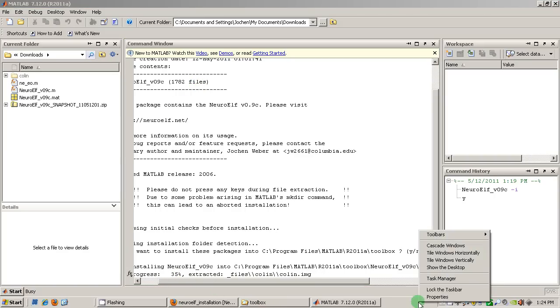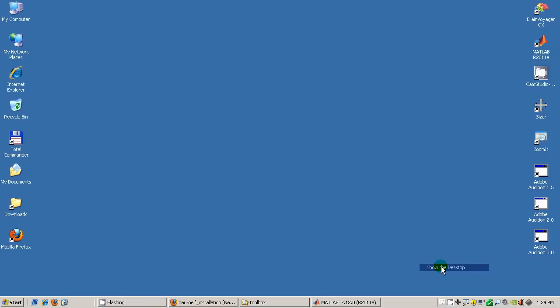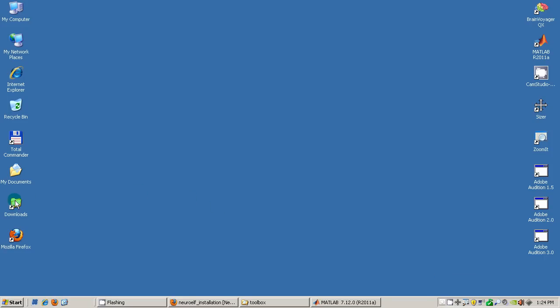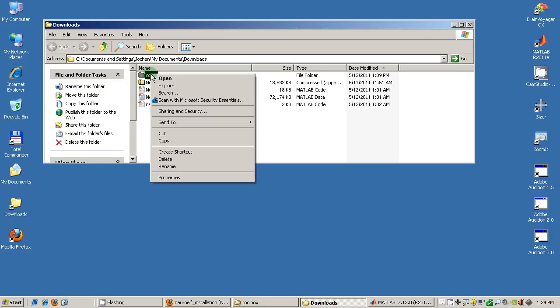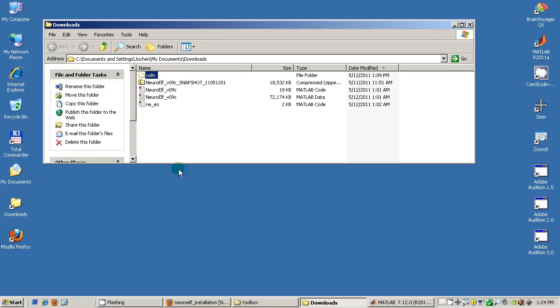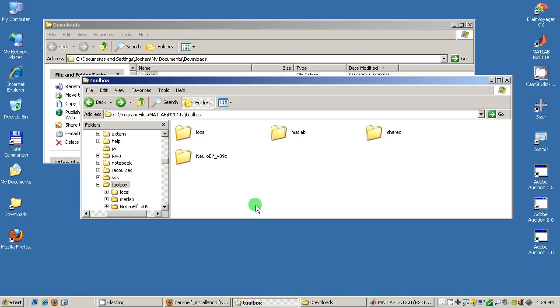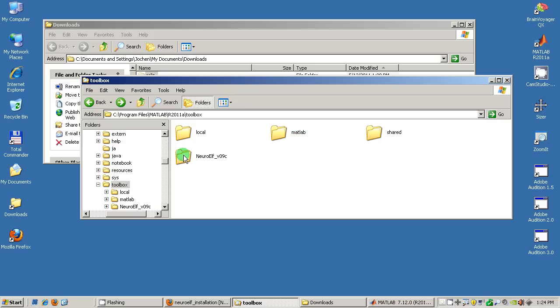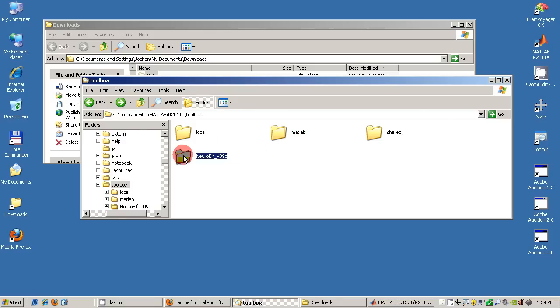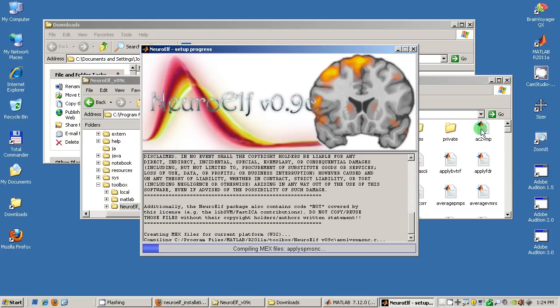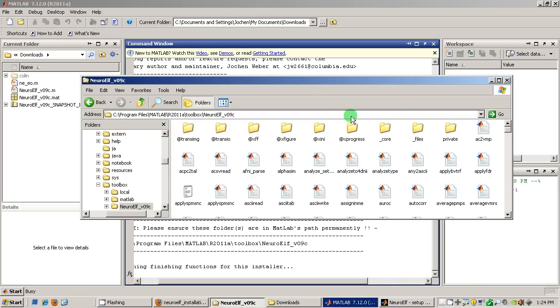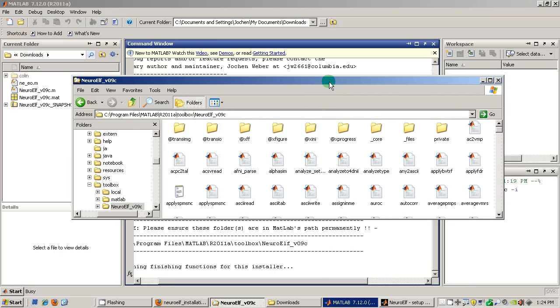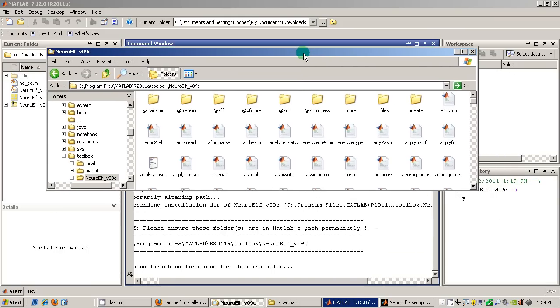Now I am quickly going back to the downloads and here I can now see this folder and I will say cut and I will then navigate to the MATLAB toolbox folder and there is this NeuroElf underscore V09C folder now.